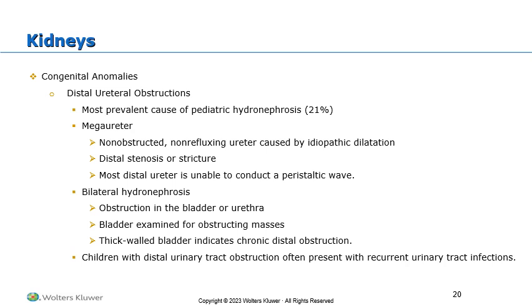Now, if the bladder is being obstructed and it can't release the pressure of that urine, we know that's when the bladder will often become inflamed or infected or hypertrophic. And so seeing a thick-walled bladder would indicate chronic distal obstruction. Also to keep in mind, we learned in our adult population that any wall thickening in a bladder that hasn't had surgery is abnormal. So even if it is not significant, if it's thickened, we definitely want to take note of that.